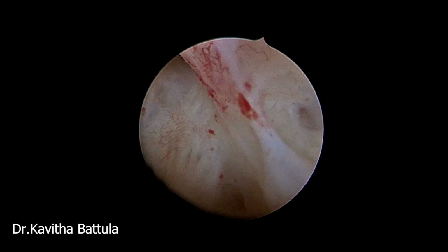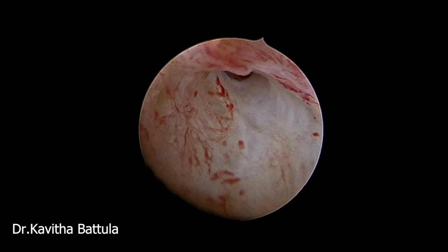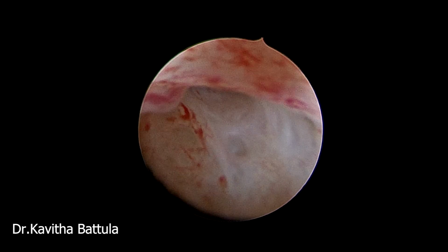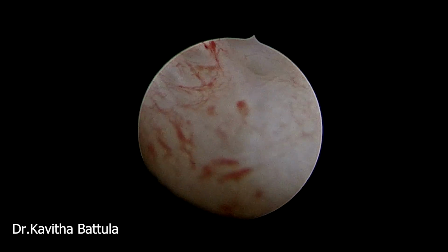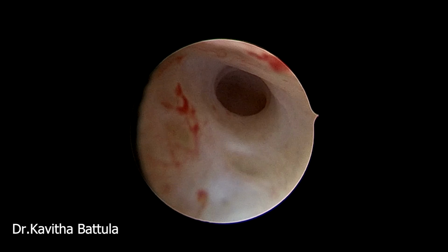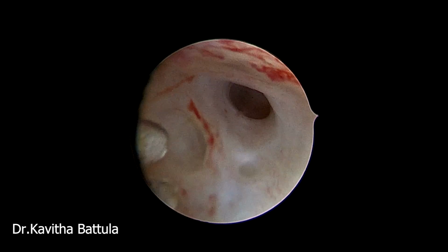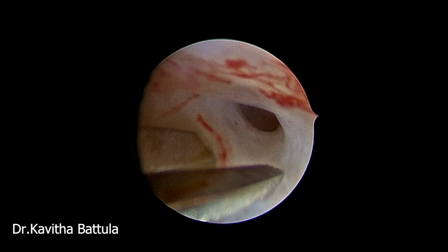Now we are going to see hysteroscopy for a postmenopausal lady. She has minimal fluid in the endometrial cavity and a hyperechoic area. So we have seen the tight internal os. We can see the scissors, micro scissors, cutting bit by bit of the tight internal os on either side.